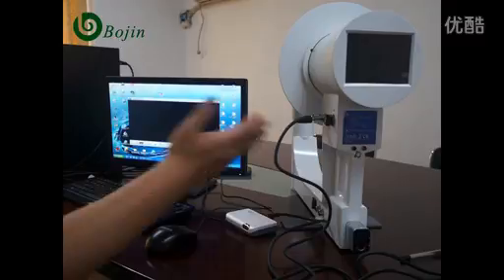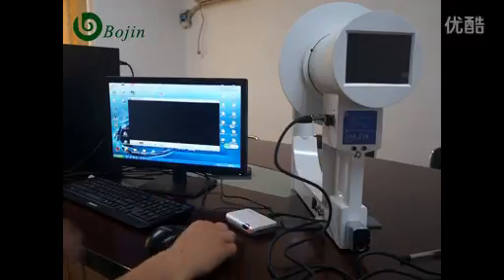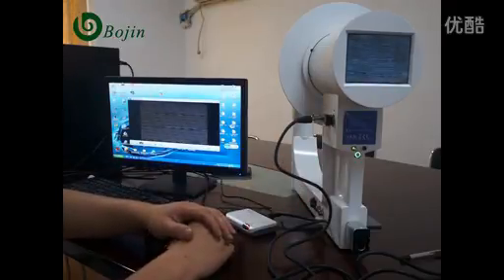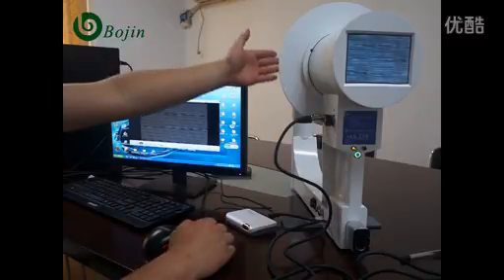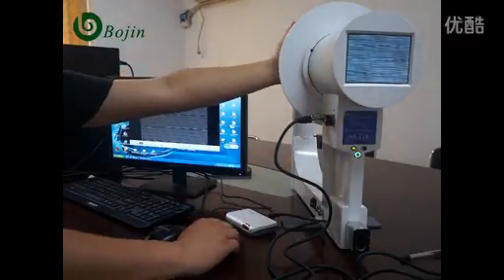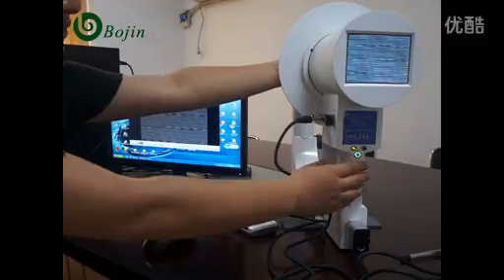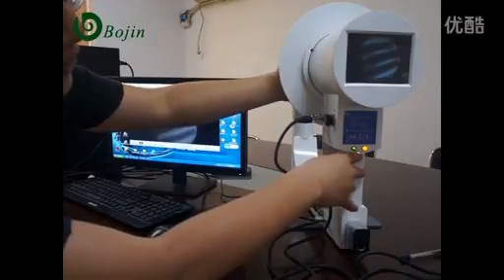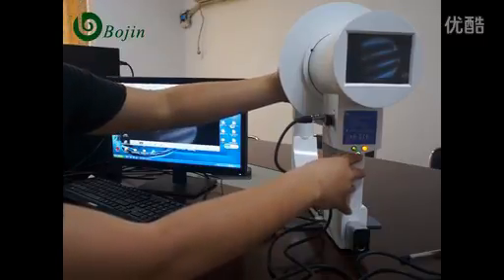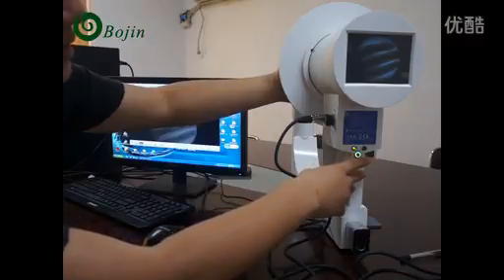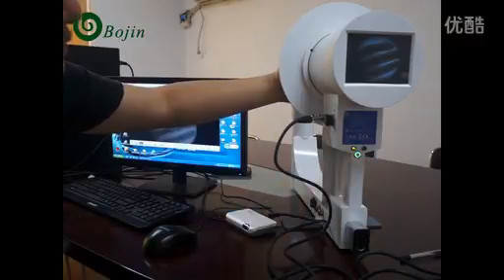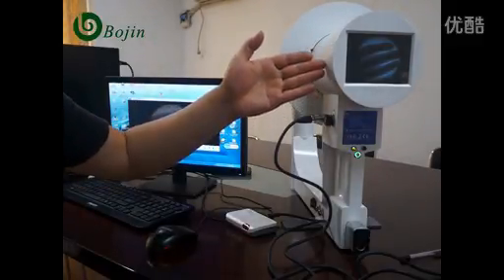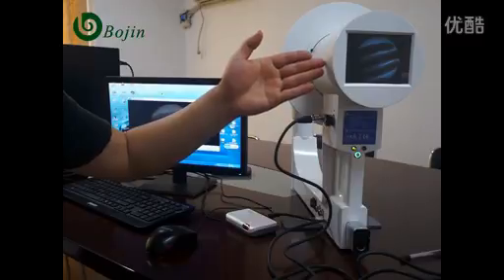Please open the X-ray instrument and switch it on. Make the radiation obstacle between the collimator and the protecting board. Click the button. Check the image. Now you will find the clear image on the X-ray instrument scanner.